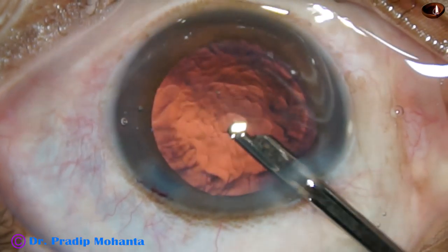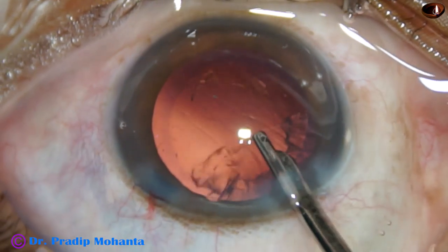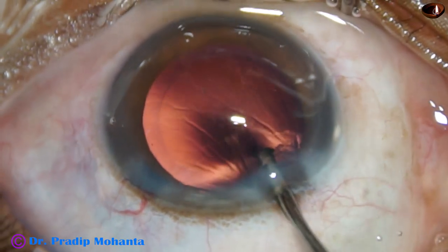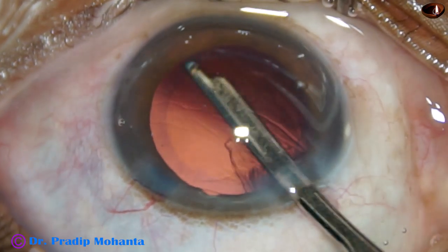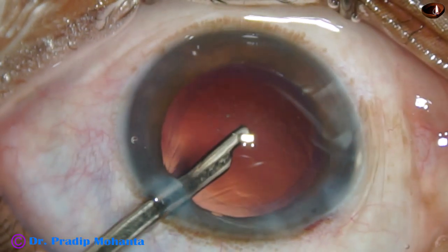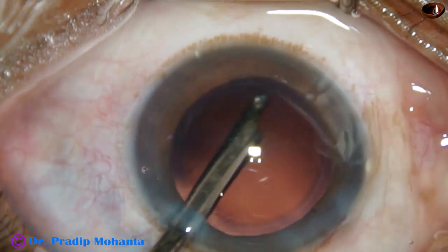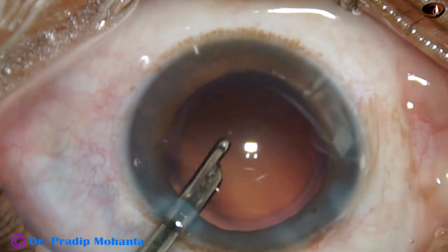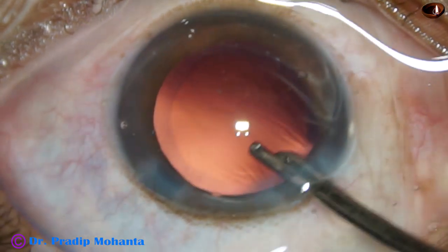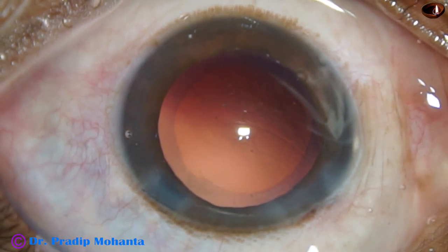A 23-gauge Simcoe cannula is being used to remove the cortex, and the cortex came out very fast in this case. The sub-incisional cortex can be removed through the side port because the side port is a little larger — 1.6 to 1.7 mm in this case — so that a 23-gauge Simcoe can go in. There is only one side port; if we use bimanual irrigation-aspiration we would use two side ports of 1 mm or 1.2–1.25 mm each, but in this case we are doing only one side port.